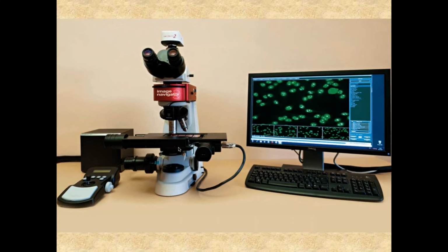And here we see the two different patterns of positive ANCA tests by fluorescent microscopy. Many of you have probably had ANCA tests run in the past. You may have them done on a periodic basis. So what we see here in the lower right is the p-ANCA pattern. Perinuclear is where the P comes from, because the nucleus of the cell is showing the fluorescent reaction. In the upper left, we see the c-ANCA pattern, or cytoplasmic ANCA, where we have little granules in the cytoplasm of the cells that are showing the staining.